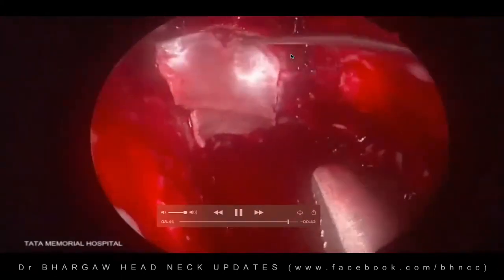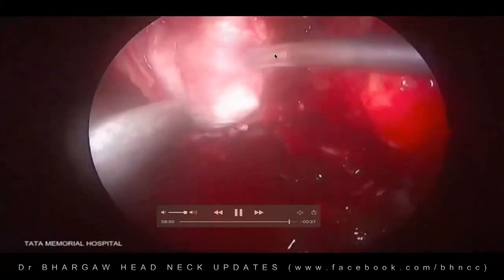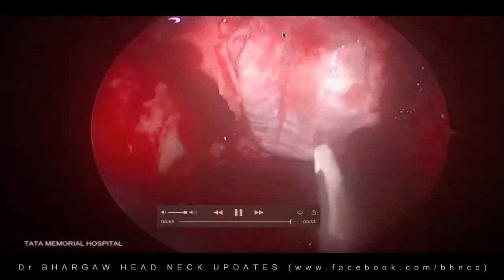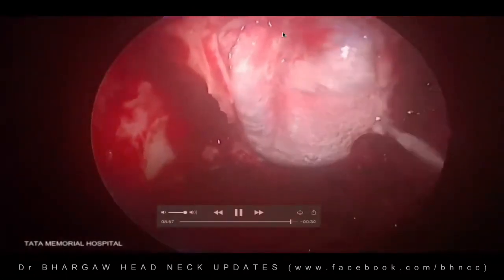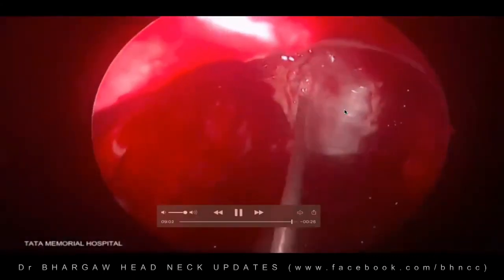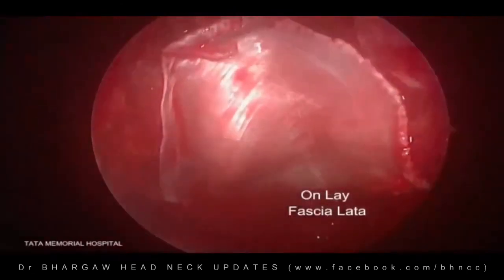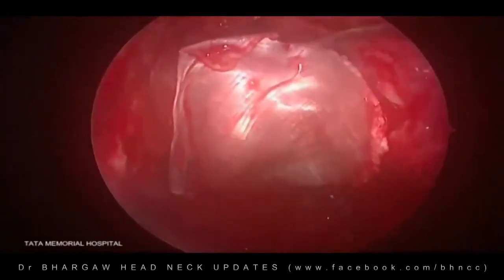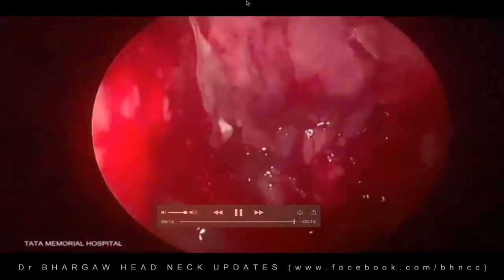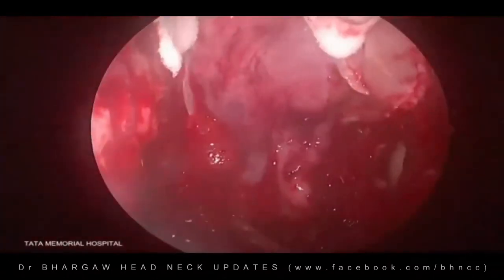So we do it in 2 layers. This layer is tucked in above the dura all around, like this, and we use the Tisseel to just improve the seal that you get. And you should get this pulsation. If you don't get this pulsation, that means you have not achieved the seal. And then on top of that, you put another layer of fascia, and this fascia should not block the frontal sinus. It should go and drape the posterior wall of the frontal sinus. Otherwise, the patient may develop a frontal mucocele.